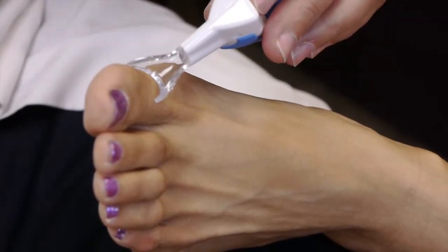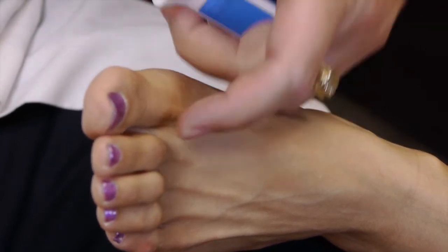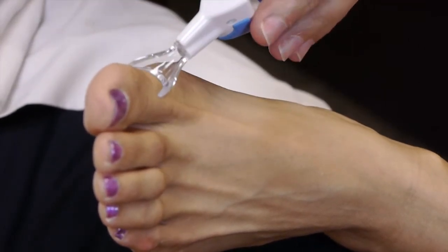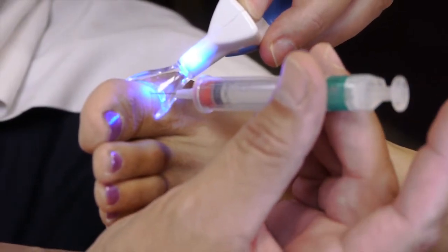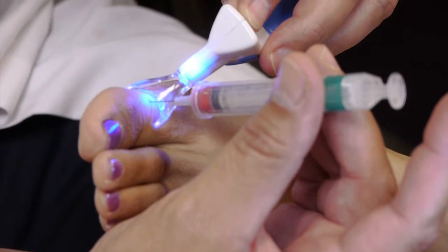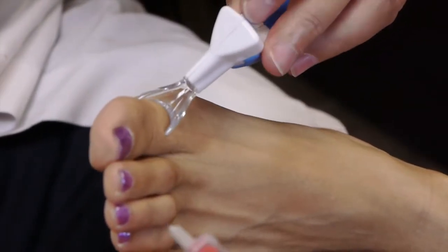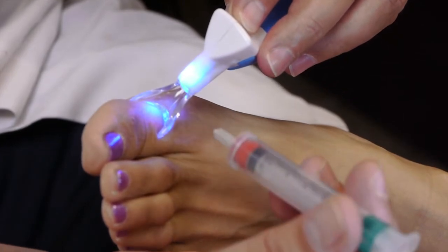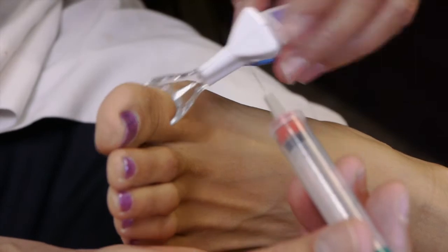When I inject the great toe, I give 2 injections, one on the medial dorsal and one on the lateral dorsal aspect of the toe. I push right here, and then the needle goes in right here, just like this. And then I infiltrate the medication, and I'm pushing pretty hard with the pressure of the device actually on the toe. If I put good firm pressure, they feel essentially nothing except the medication going in.